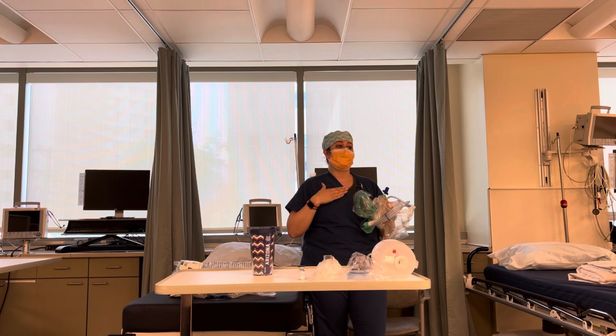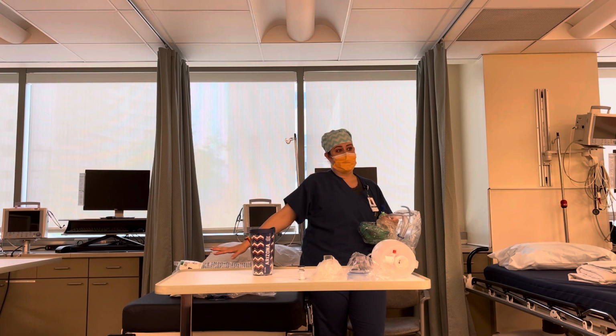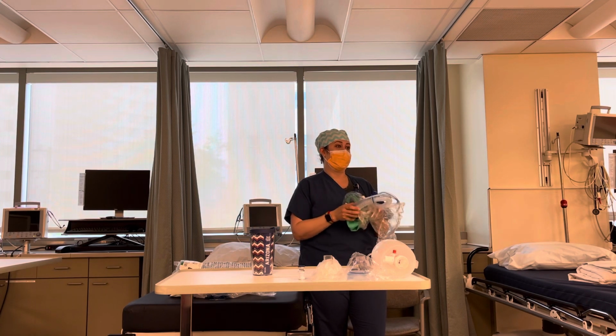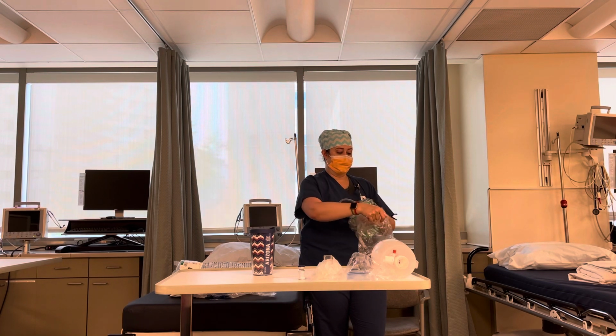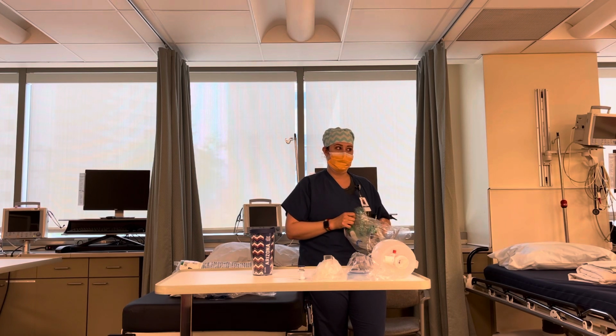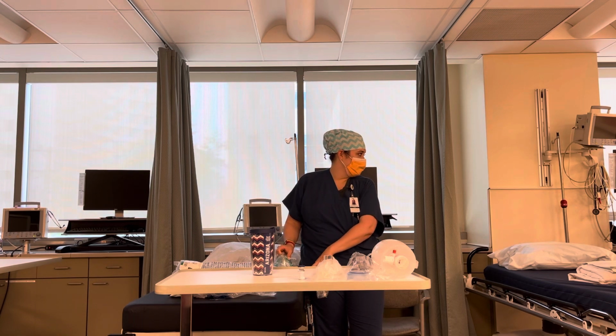And again, that's us, CRNAs. It's our responsibility to have it, we check this every day. It's in our bottom drawer. But you guys need to know what this is if we ask for it. You've seen some of us, we have a patient that we think, oh, they might give us trouble. We'll just put it out on the counter before an upper, just so you don't even have to go to the bottom drawer to find it.